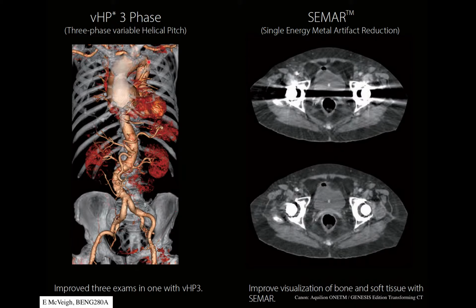You can now very rapidly get images of the entire body, essentially from head to toe, on a CT scanner. You just push the patient through the scanner and continuously acquire data, right? In this case, we're going from this patient's collarbone all the way down to the bottom of their pelvis in order to measure the function or the shape of their aorta.